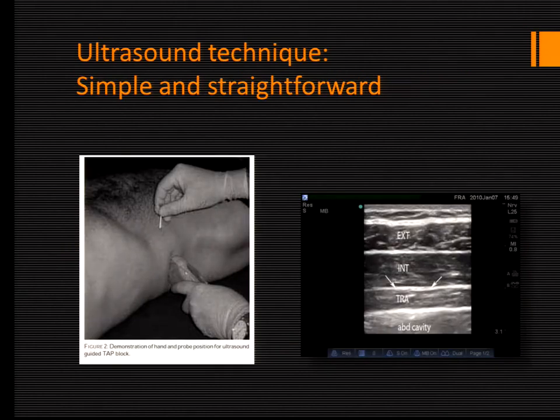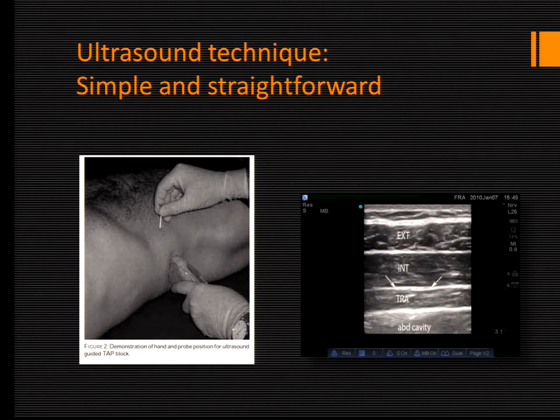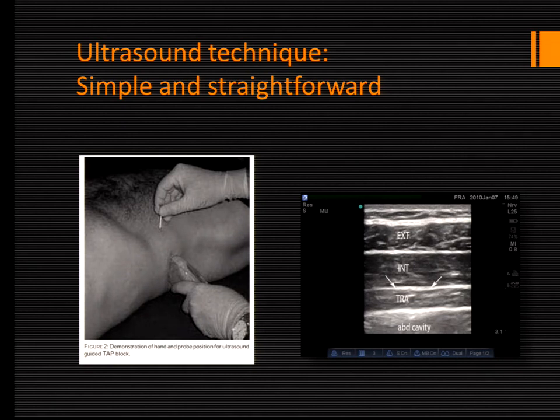Here you can see Herbert's picture — pretty straightforward. This is distal, this is proximal. This is the subcostal margin, and here is the iliac crest. The probe is placed laterally and the needle is advanced to the plane between the internal oblique and the transversus. The internal oblique usually is the largest of all three muscles, the transversus usually is the thinner, and here is the abdominal cavity.